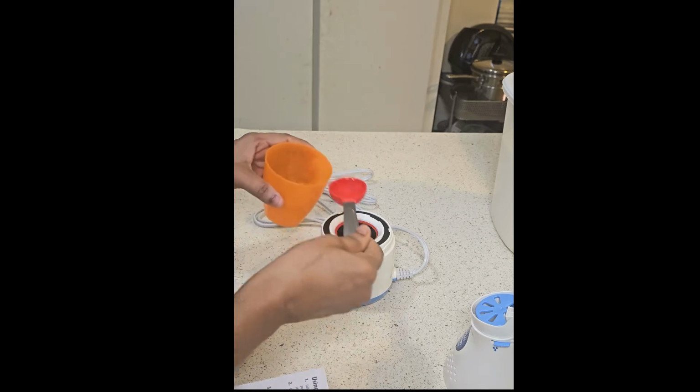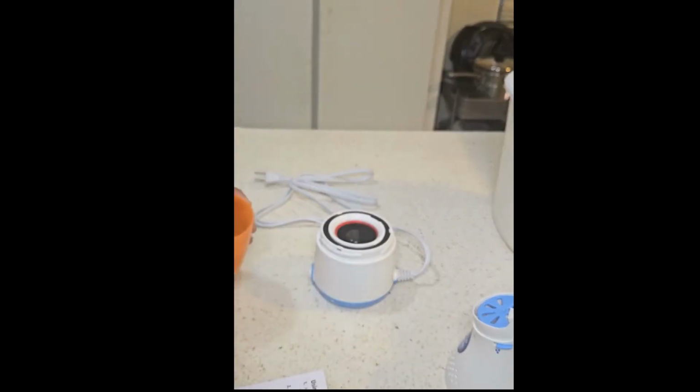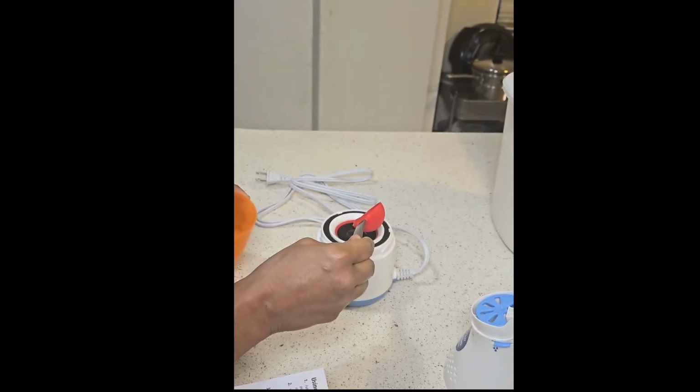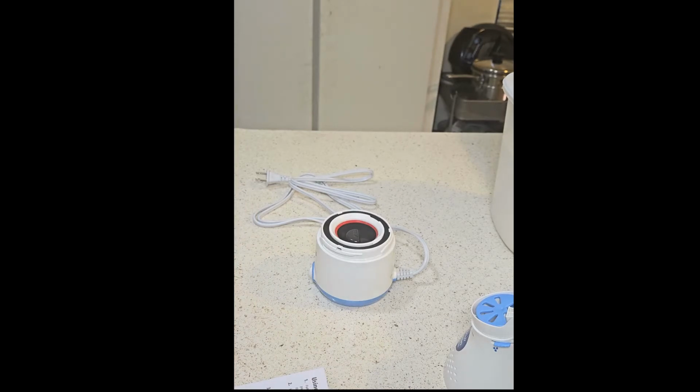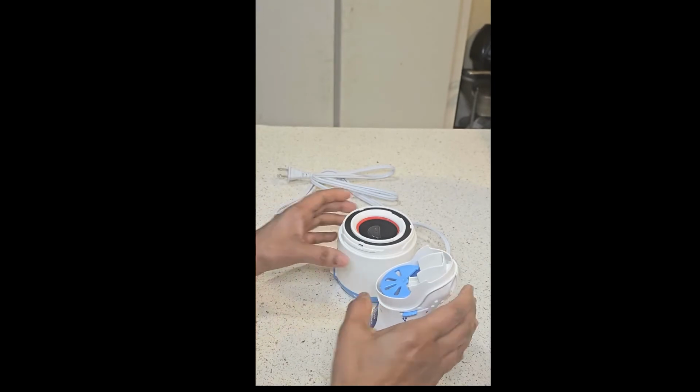Fill water reservoir with up to 2.5 tablespoons of cool tap water. Do not fill above heating element. Use with water only. Do not add any essential oils, medications, or inhalant liquids such as Vicks VapoSteam or Vicks inhalant to the water reservoir.